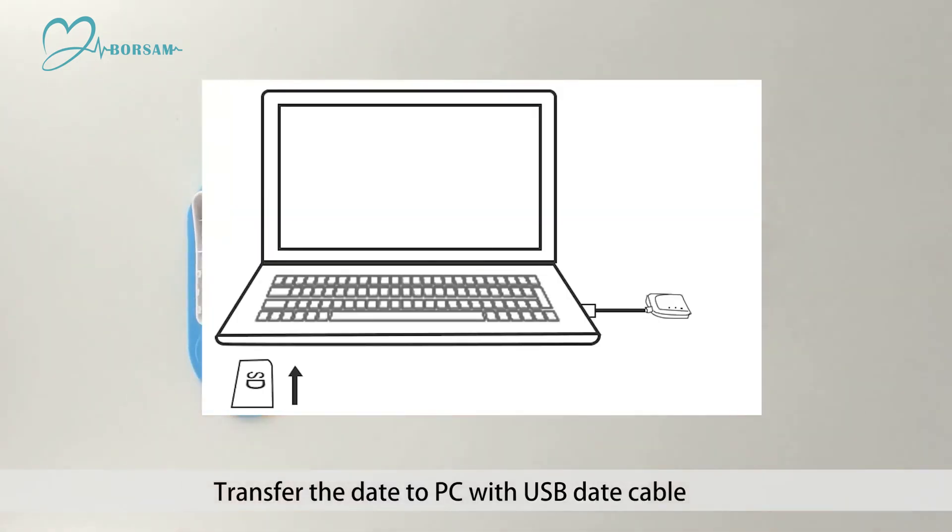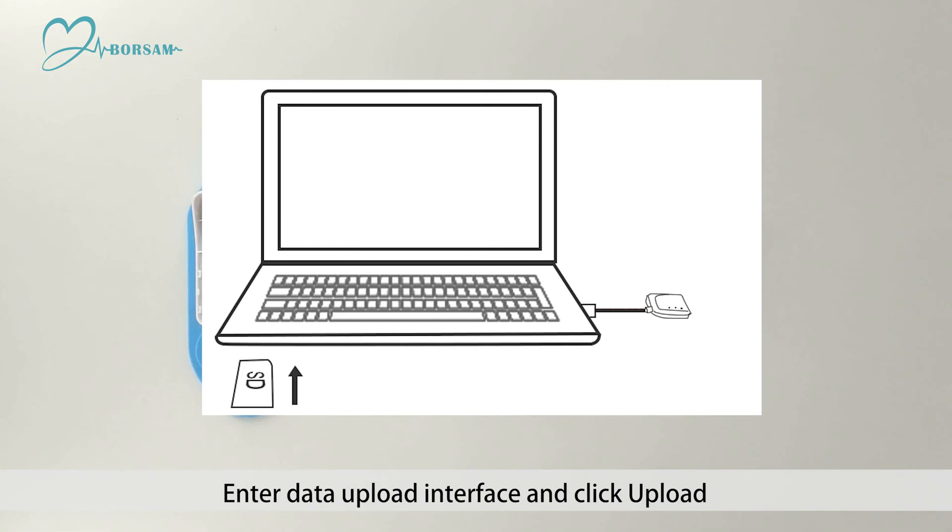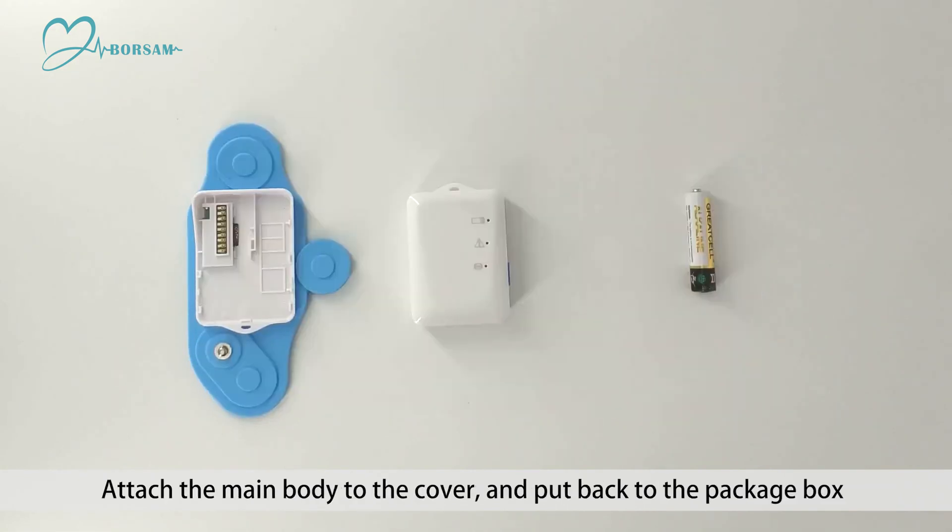Transfer the data to PC with the USB data cable. Enter the data upload interface and click upload. Attach the main body to the cover and put it back in the package box. Thank you.